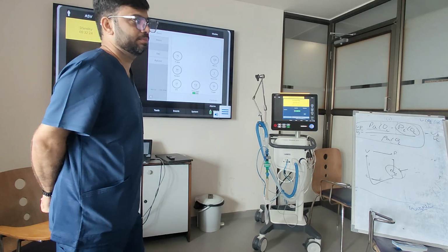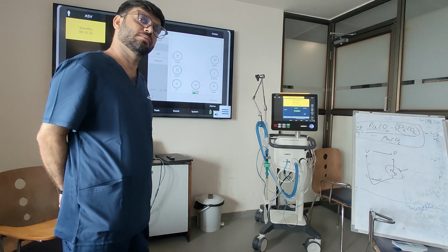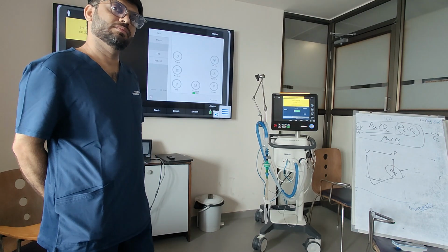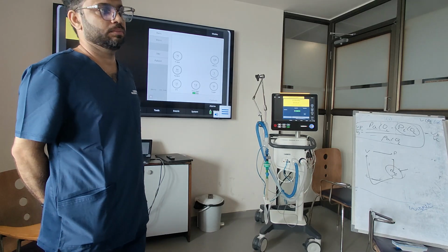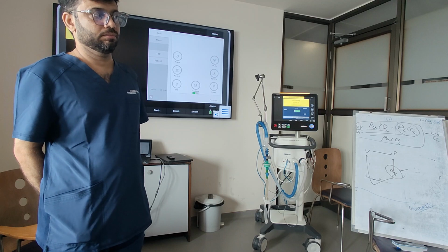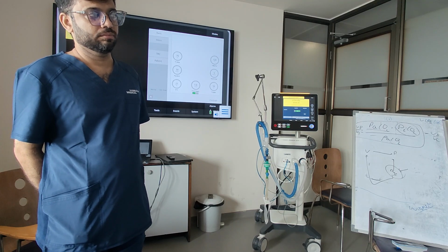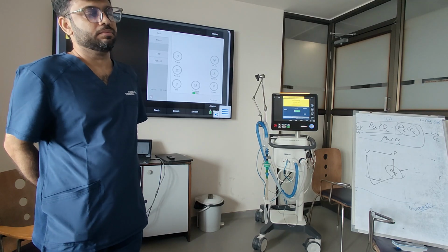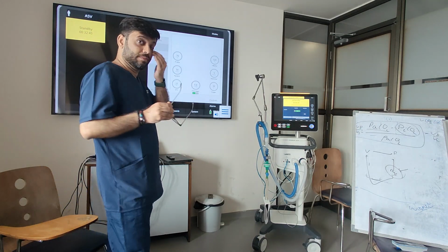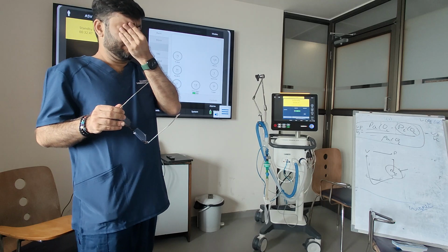Okay. Second question. As a novice, what should it be? Should it be 100% of the minute volume every time? To start with, it depends on the case. So 100% for a normal lung, ARDS higher, asthma lower, fever higher. Simple. And the change is 10 or 20%. So if it's 100, then 80% for asthma maybe, 120% for fever.